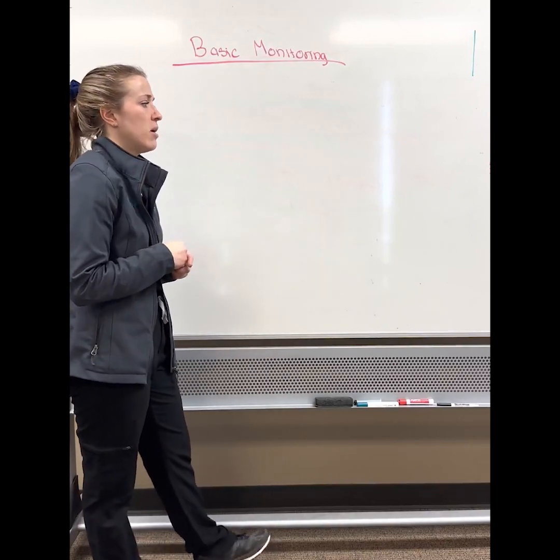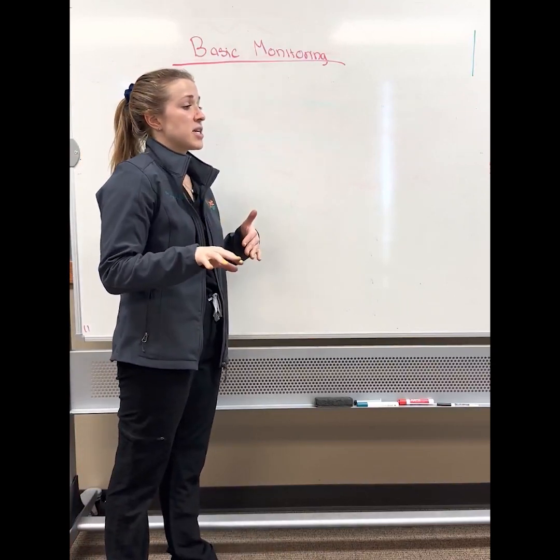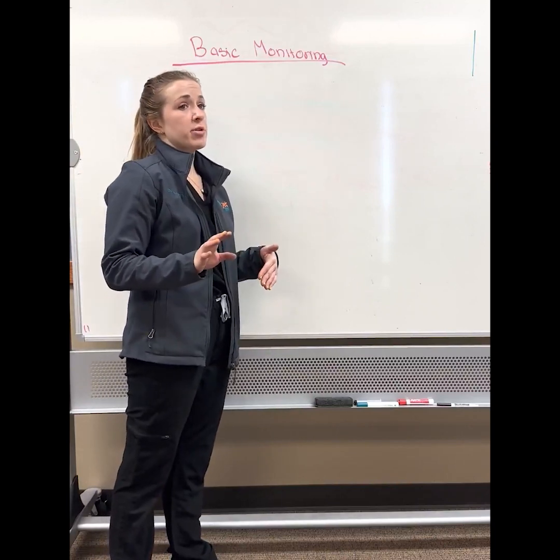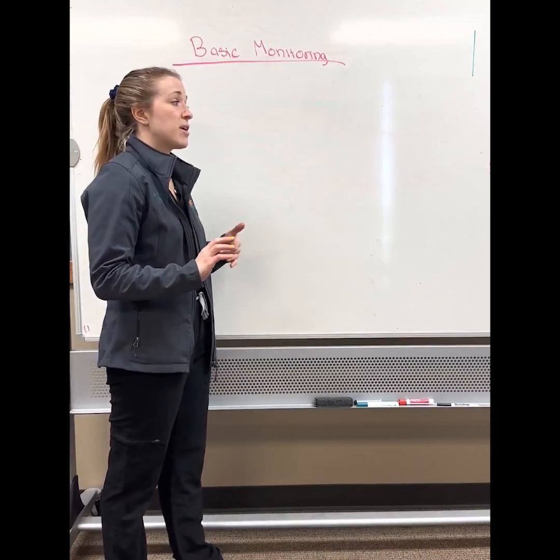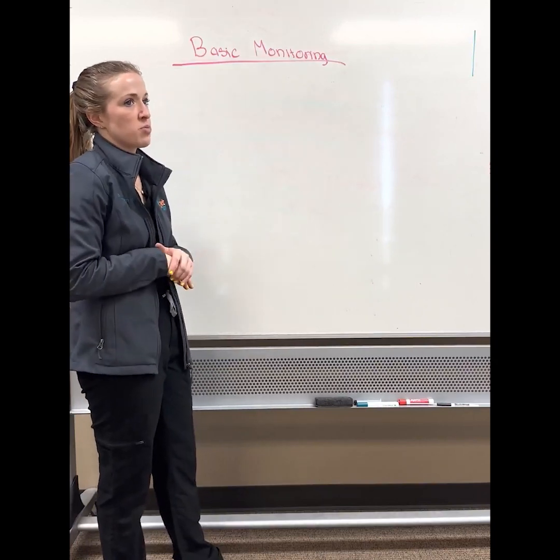So in summary, for every sedated and anesthetized patient, put some monitoring on it, understand what those parameters actually mean, what they do and don't tell you. And when you're done with your case, try to take good care of your equipment, because this stuff can last a really long time. If we're taking good care of our stuff, then we should be able to trust what our vitals are.